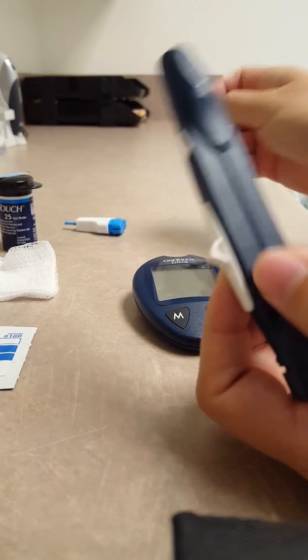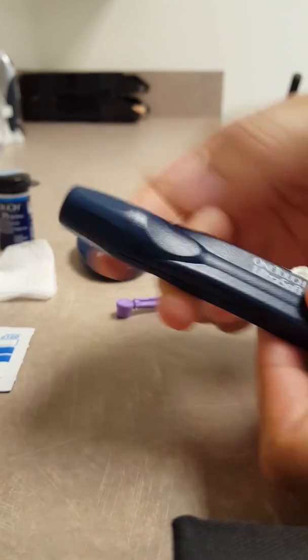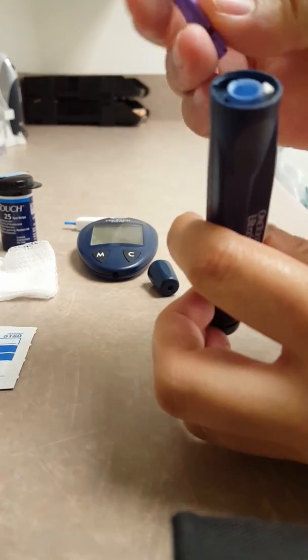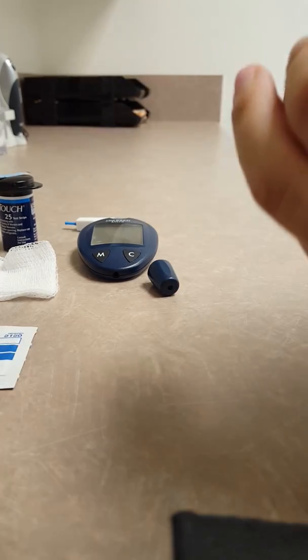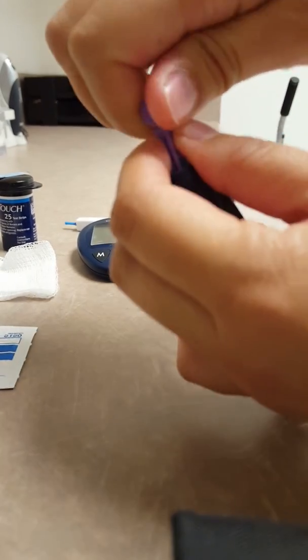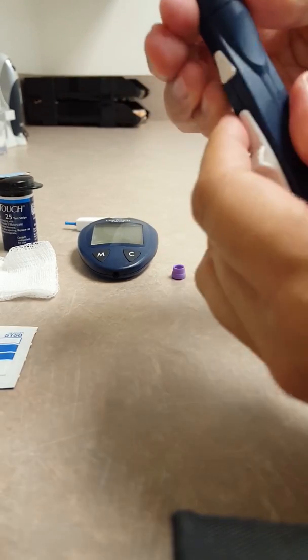So how you're going to want to set this up: you should have these nice little lancets. You are going to put it into the lancet device — so this one you will twist off the top. You can see inside there it has a little area for you to set your lancet in. So the way that I do this: you'll insert the lancet, and then I'm going to push down. And then this will twist off the top, exposing the top of the needle. Then you will put the cover back on and twist it on. Be careful not to poke yourself as you're doing this.